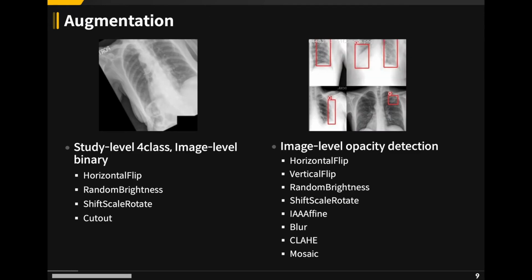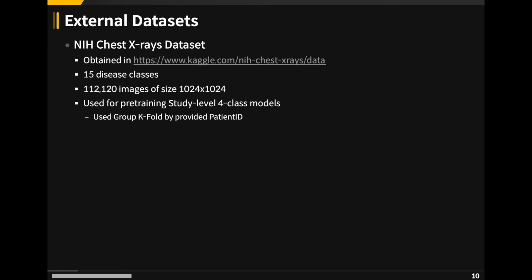Augmentation is one of the keys to improving performance, and we use the NIH chest X-rays dataset for pre-training study level models.